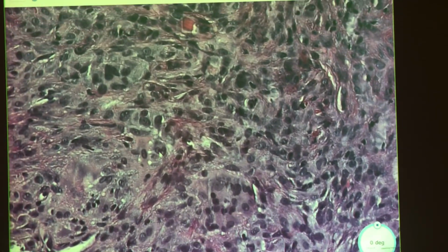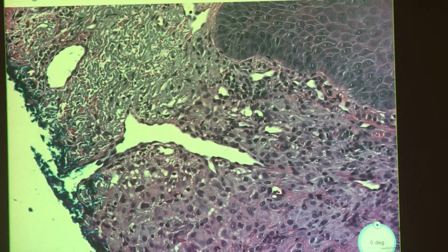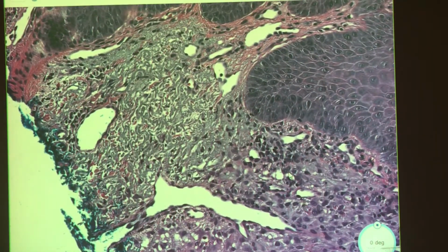Is that nucleoli here? Kind of. They look pretty small. But they're right up in the papillary dermis area. Yes. They do get a nice border here.